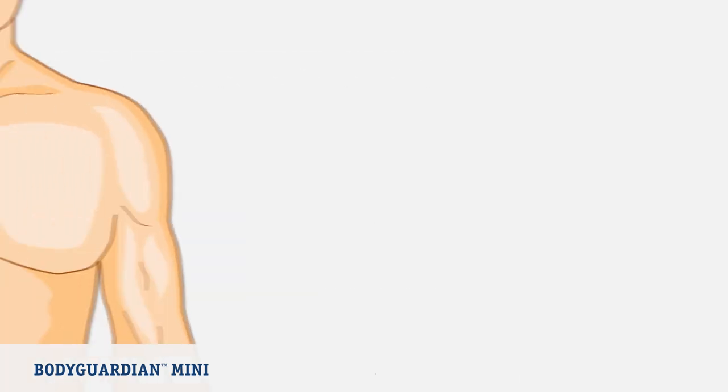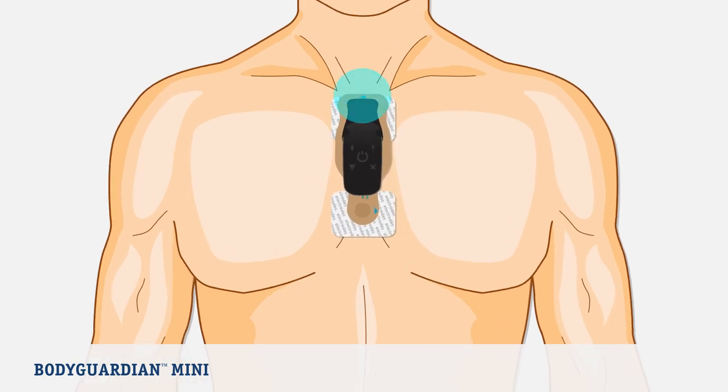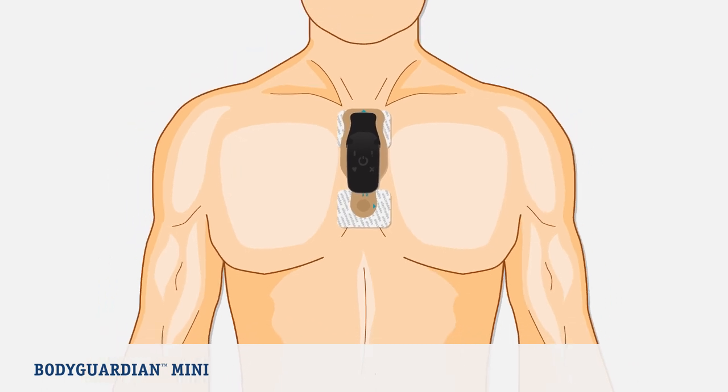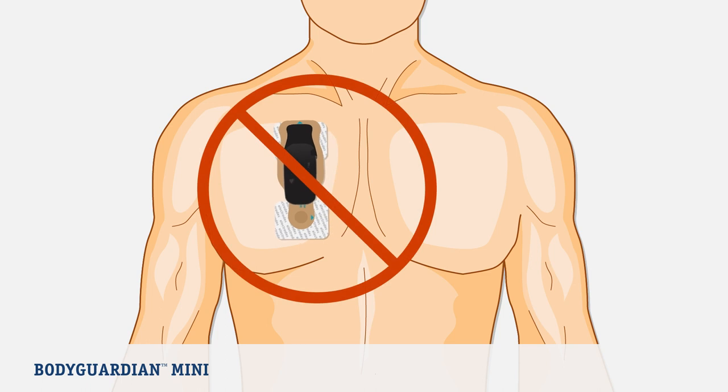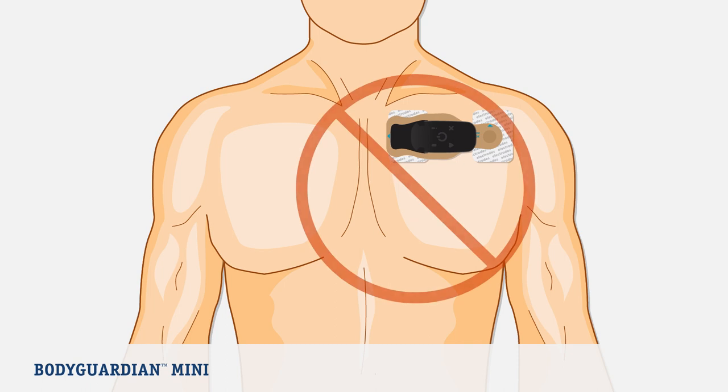Now it's time to place the BodyGuardian Mini on your chest in a selected location. If you choose the preferred vertical placement, you will place the top of the bridge just below the jugular notch at the base of the neck, at the intersection of the collarbone. Do not place the bridge too far to the right or too low. If you select the horizontal placement, place the right side of the bridge near the center of the chest over the sternum. Ensure the arrow on the bridge, over the left chest near the left arm, is pointing up. Do not place the bridge too far to the left or too low.